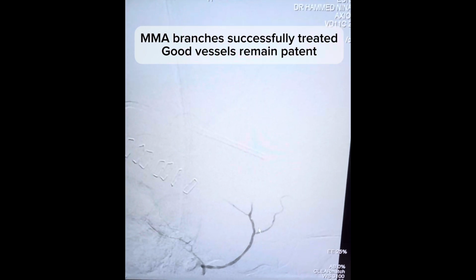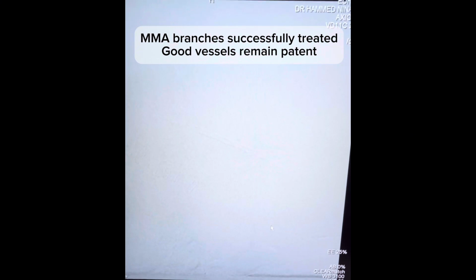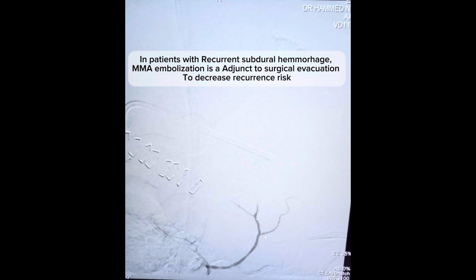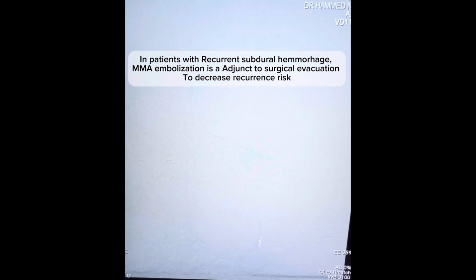We were able to successfully treat the frontoparietal branch and the temporal branch of the middle meningeal artery, and keeping that meningeal/orbital branch patent. Again, we do not want to treat that vessel to reduce the risk that this patient could have blindness. And the goal essentially is to prune these vessels up here without hurting this vessel, which was done successfully.